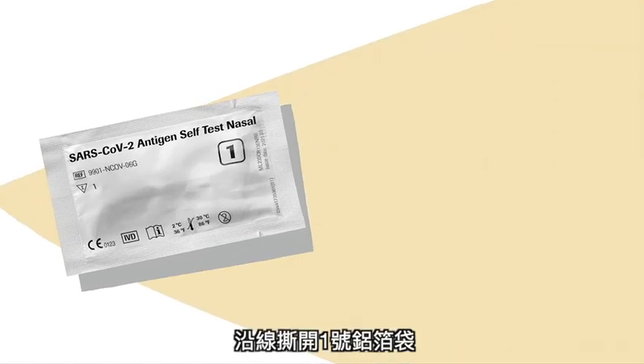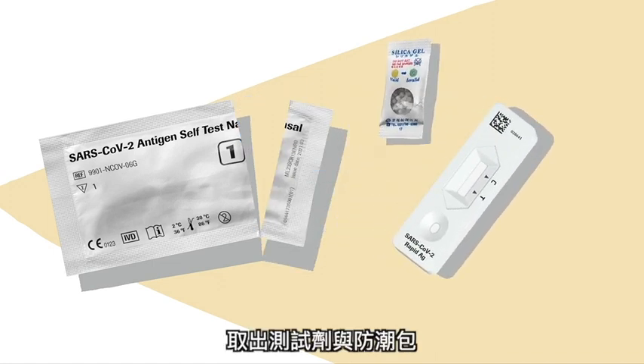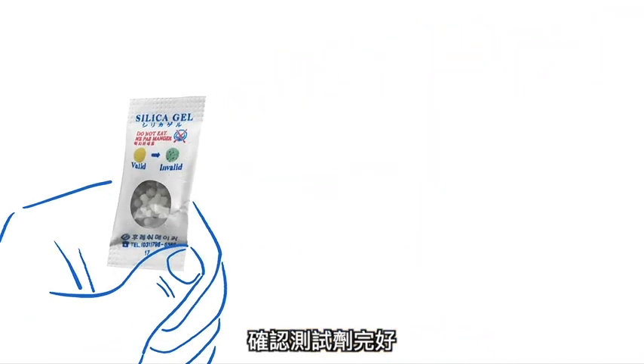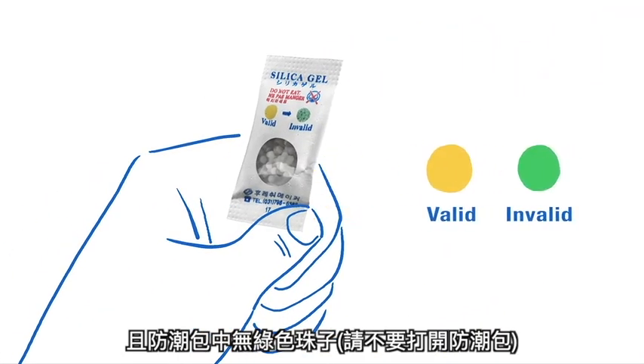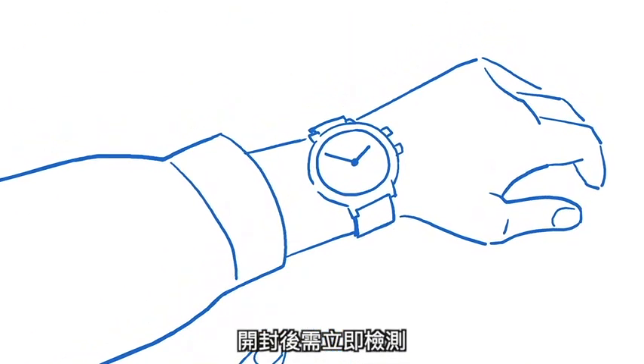Open one of the pouches marked with a 1 along the tear line and take out the test device and the desiccant package. Ensure that the test device is intact and that there are no green beads in the desiccant package. Use the test immediately after opening the pouch.